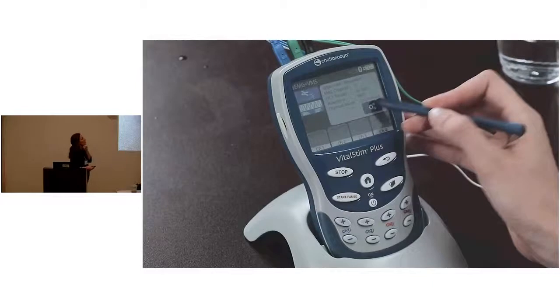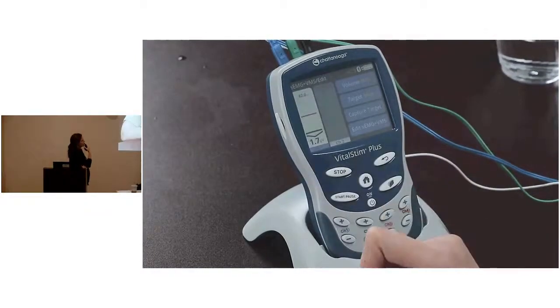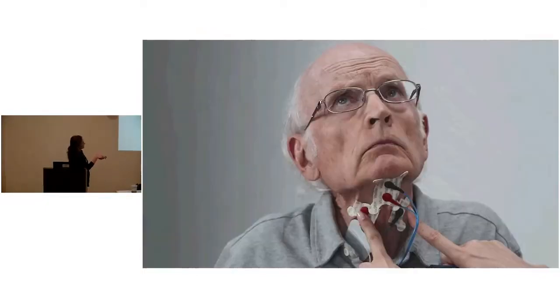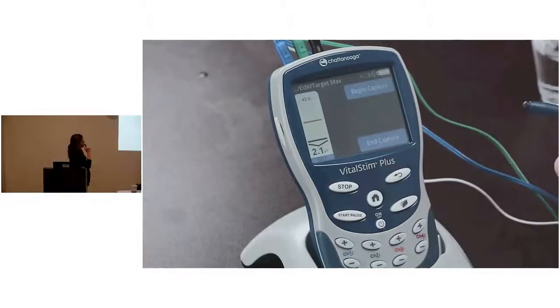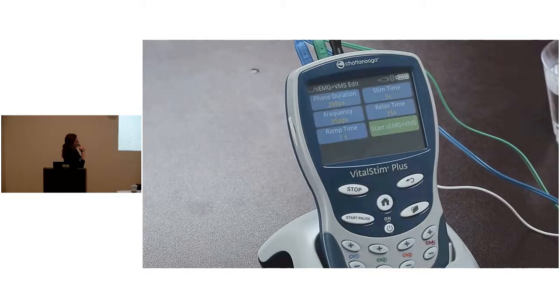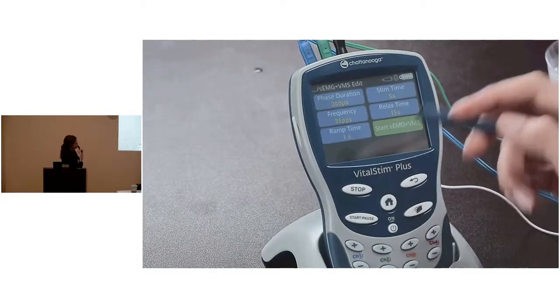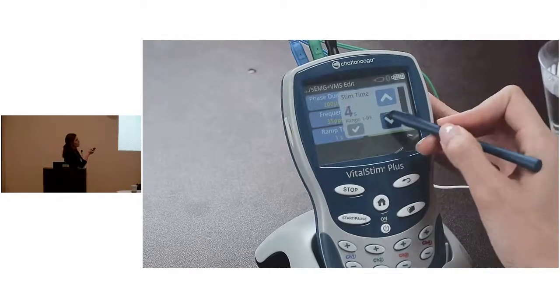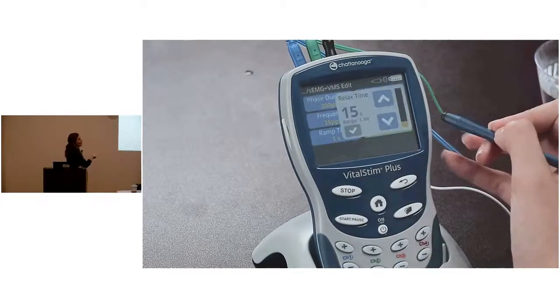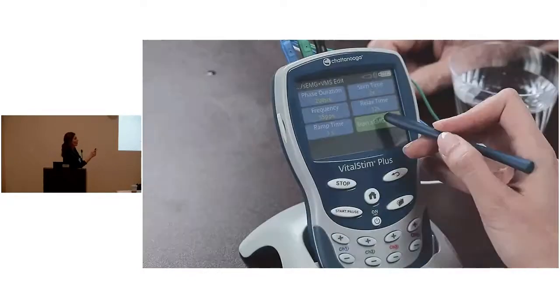Now he's got more electrodes on him. He's got one here and then two. We're going to put them in with the biofeedback. His grounder is like right there. That's like some in the way. Really big. And a lot more parameters. It's cool because you can stim them and try biofeedback. They have to be really cognitively aware to be able to do it. But patients love it when they are cognitively aware and can do it because it is real.